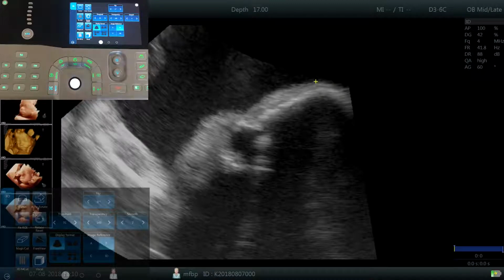We're going to take a look at editing a 3D ultrasound image on the Vinno portable units. One of the most important things is that we start off with a good 2D image when we're trying to do 3D. So hopefully you'll be able to get a 2D image which is like the one that we have on screen here at the moment.